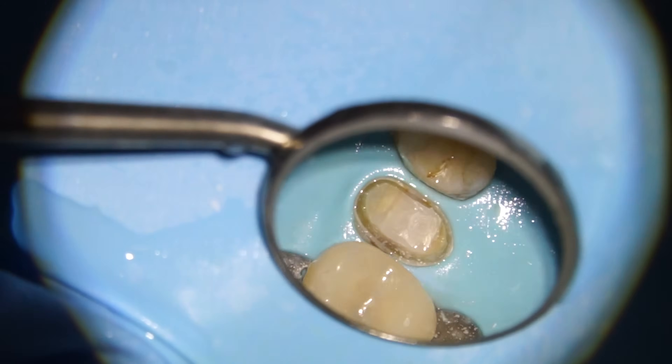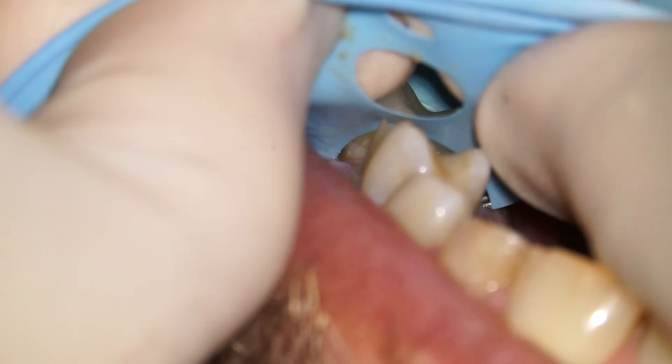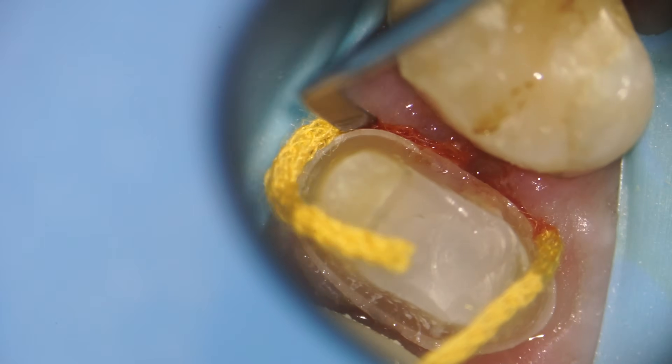After we get the basic shape established, I like to move the rubber dam out of the way so that we can do some refinement. The next step is to put a knitted cord in place to push the gums out of the way so that I can trim the tooth to the appropriate level safely.